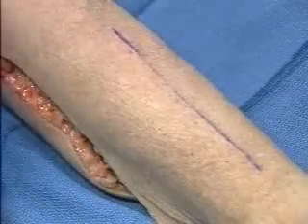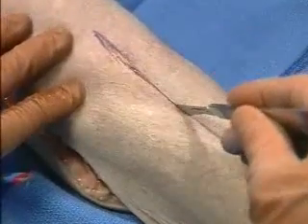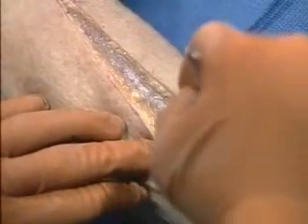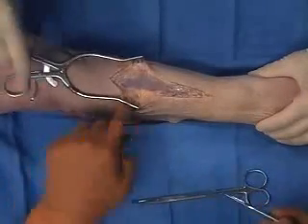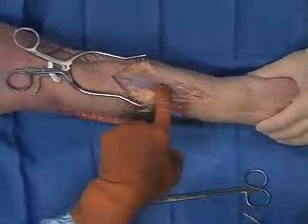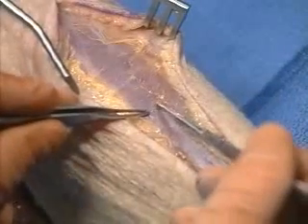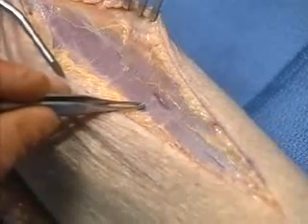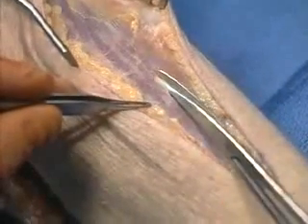Dorsally, you're going to use a single longitudinal incision. After making the skin incision, you're going to expose the extensor compartment or dorsal compartment of the forearm. Then we'll make a small incision using a 15 blade and use scissors to release our compartment.